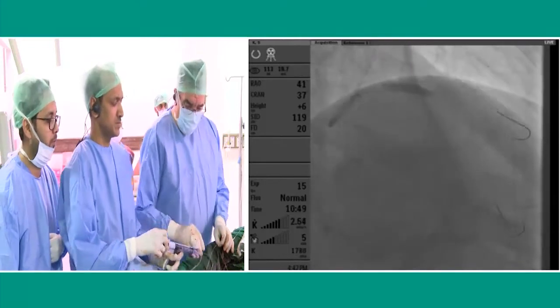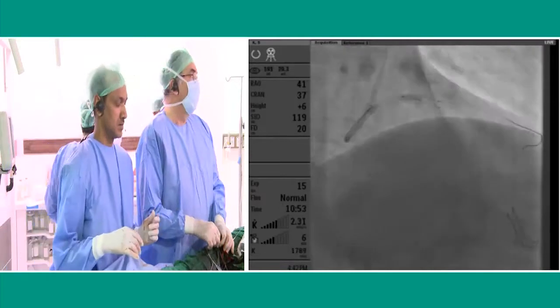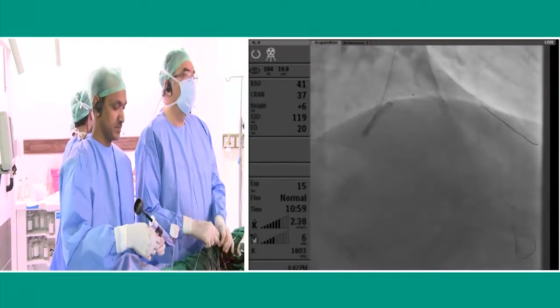Okay, stop. And now give me the 4.5. Yeah, 4.5 now. 4.5 by 10, no problem. It could be a short one.